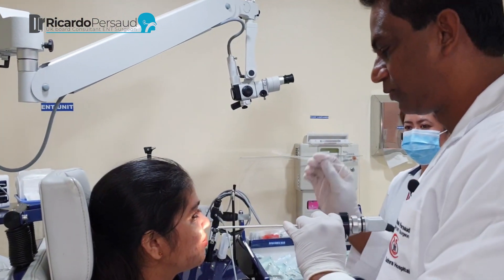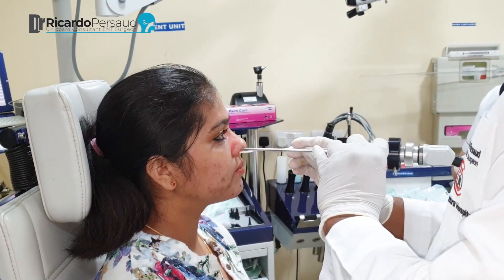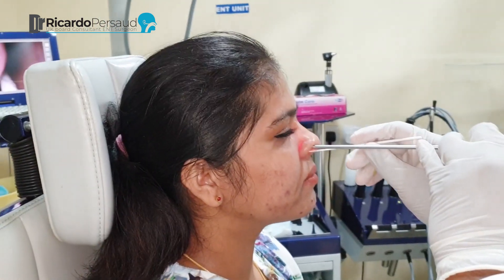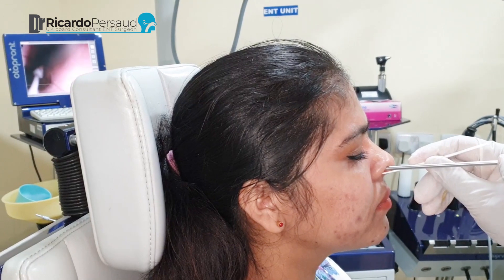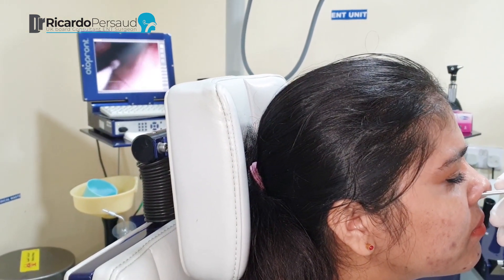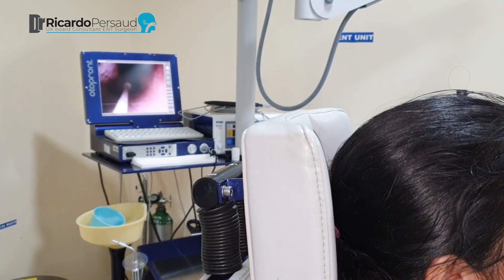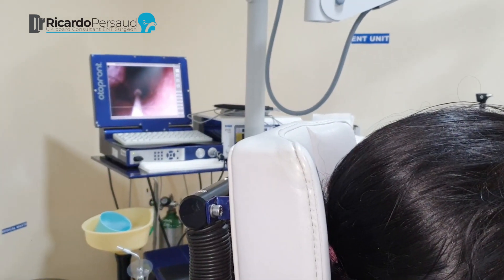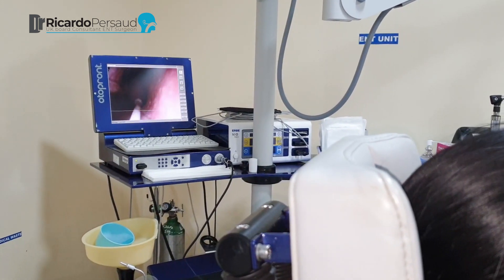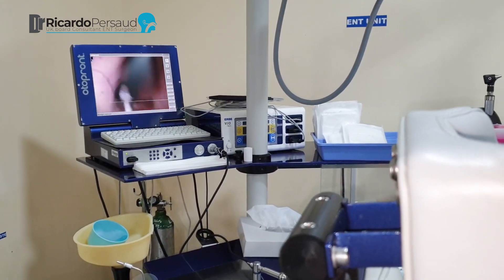Now we're going to go into the nose with the same swab and I'll show you how to get to the nasal pharynx. So you go along the floor, all the way along the floor to the back of the nose — and that's where you want to be. You don't want to be at the top. You want to be all the way along the floor to the back of the nose — that's the nasal pharynx. And you turn it a couple of times, and your sample is completed.